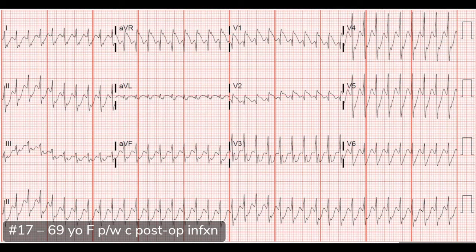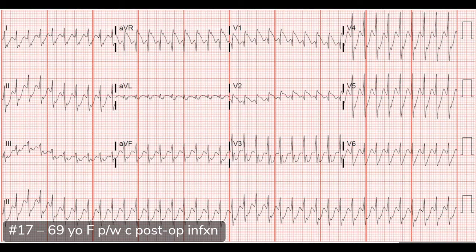Next case. This is the ECG of a 69-year-old woman who recently had an intramedullary nail placed by orthopedics and was following up in clinic. They were concerned about infection at the surgical site and sent her to the ER. This ECG is a wide complex tachycardia — super fast, around 240 to 250 beats per minute — and the complex is wide.